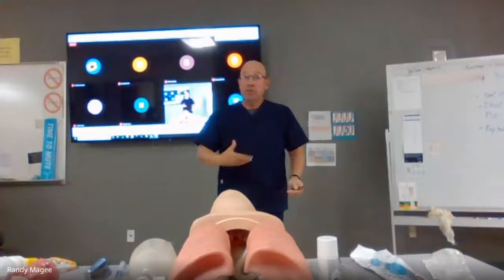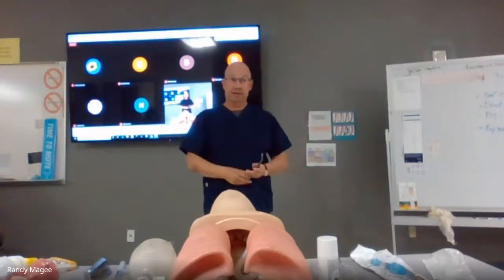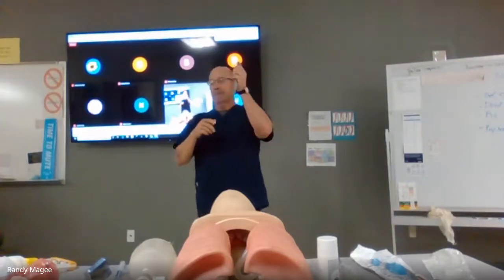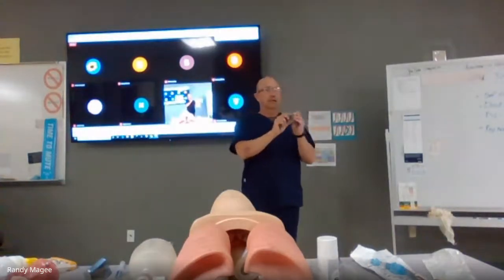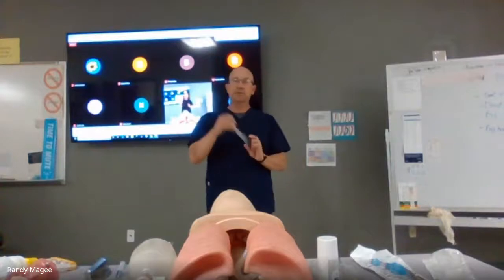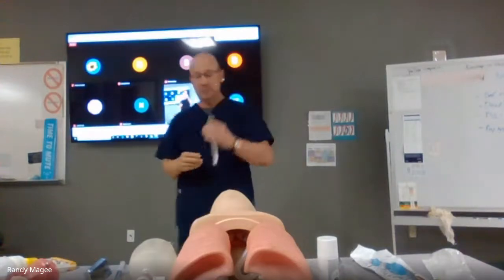Those football players don't have any. They don't have a neck. They're hard intubations. The obese patient, they're hard intubations. So I would use a Miller on that because of the way that the anatomy is. The Miller blade is really good for anterior airways and also pediatrics. I wouldn't use a Macintosh or a curved blade for pediatric. I'd use a Miller blade because most pediatrics are anterior. They grow out of it. Okay, so they do that.